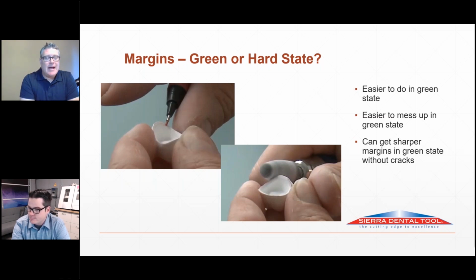But time and time again, the guy that's cutting the units out is usually the same guy that's taking out the trash for most places. They don't believe that it needs a skilled technician to work on this. You do. Because they're thinking, I need to get that unit in the oven and out the door, not realizing that if I get that unit in the oven and it's polished and it looks good, it's going to come out and drop right on the model, and you just pretty much need to glaze it. It's a big time saver to spend a few minutes here rather than a half hour later.